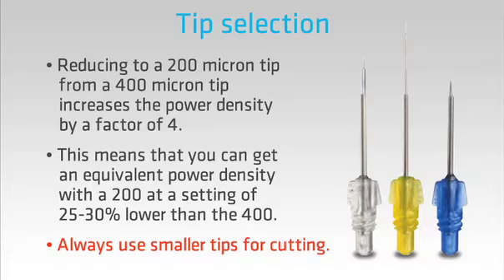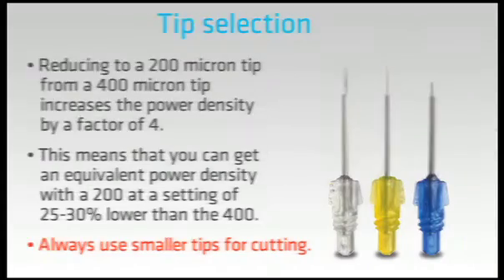Always use smaller tips for soft tissue cutting. Keep the bigger tips for when you don't want to cut tissue, such as when troughing around a crown prep to get hemostasis, or for perio-disinfection.